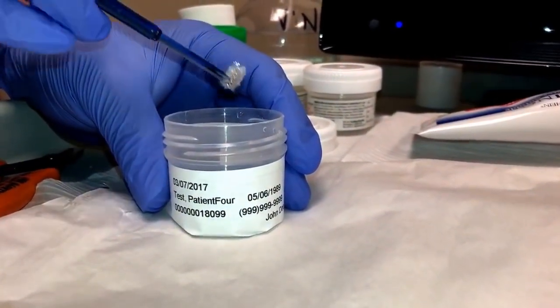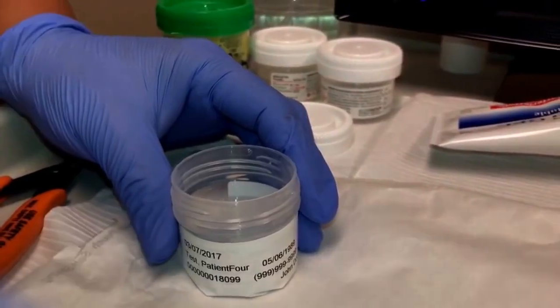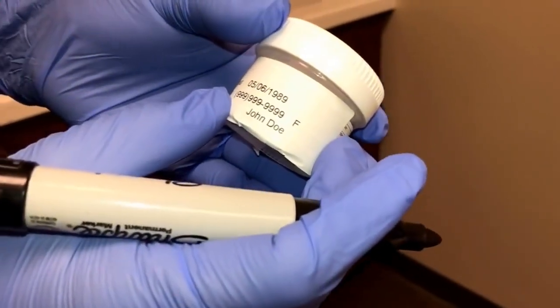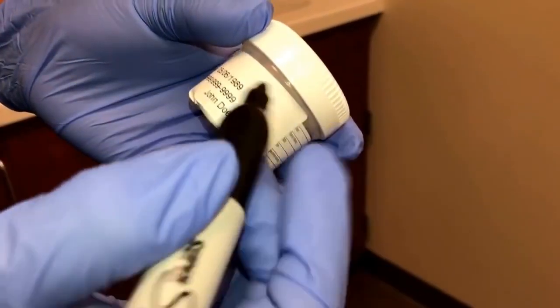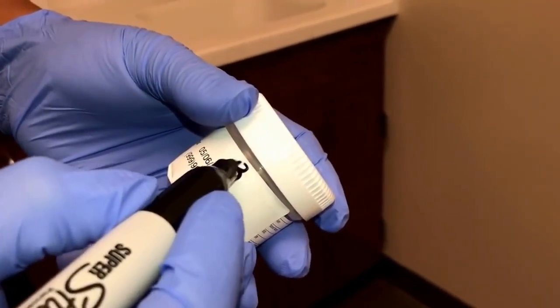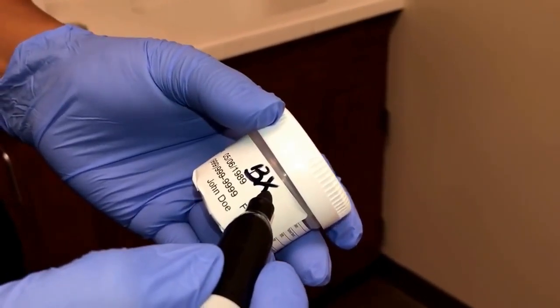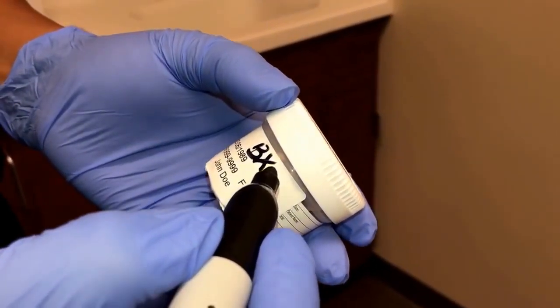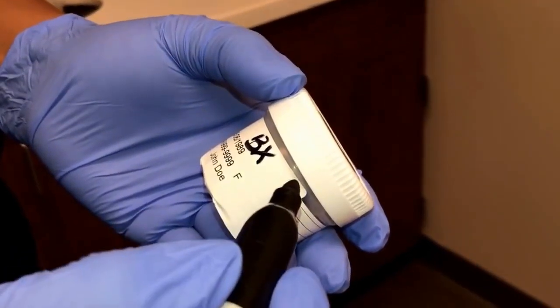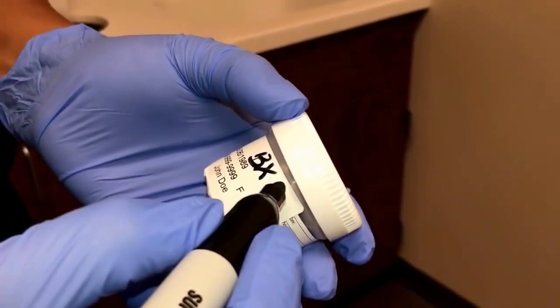This one, however, does snap off. After the specimen is placed into the vial, you will need to write 'BX,' which stands for biopsy, and the provider will tell you the location of that specimen — whether it's 12 o'clock, 1 o'clock, 2 o'clock, etc. This one was taken from 1 o'clock.